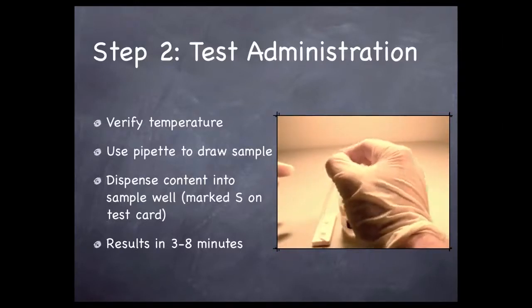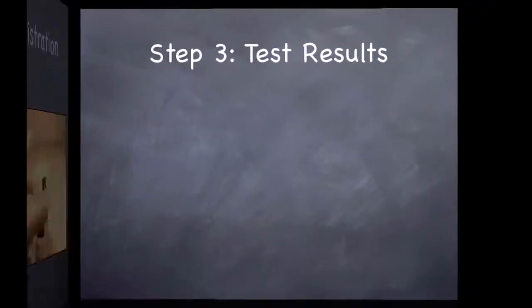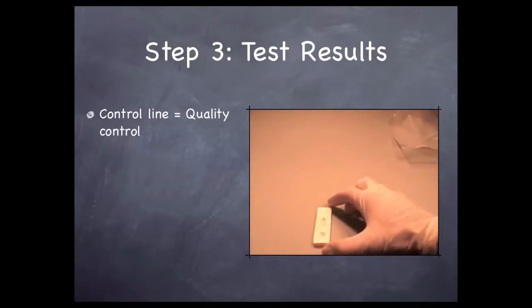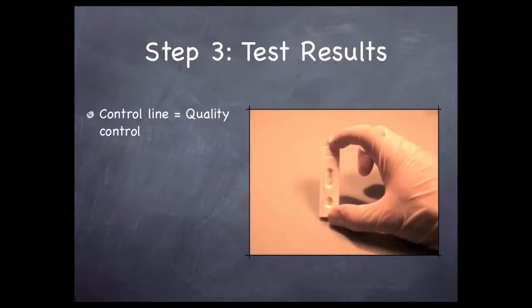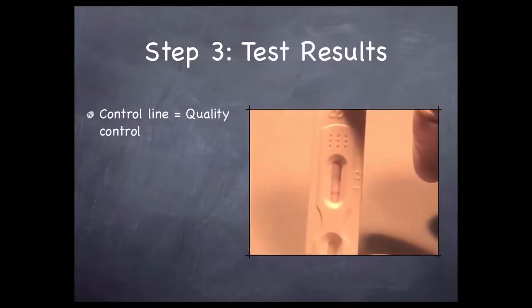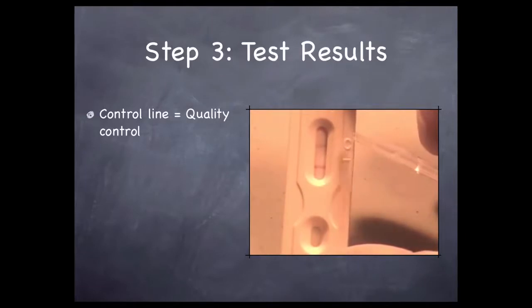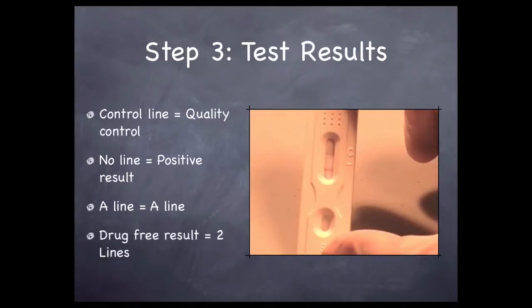Step 3. Interpreting test results. Read the results between 3 and 8 minutes, not after 8 minutes. You want to see a line next to the C, which stands for the control line, as in quality control. This means the test worked exactly like it was supposed to and there's nothing wrong with it. If there's no line next to the C, then the test is invalid. You also want to see a line next to the T, which stands for the test line. If there is a line next to the T, then your teen hasn't been smoking recently. This is the kind of result you want to see. If there is no line next to the T, and there is a line next to the C, then the test is indicating the recent use of tobacco, and the control line is indicating that it is a valid test.